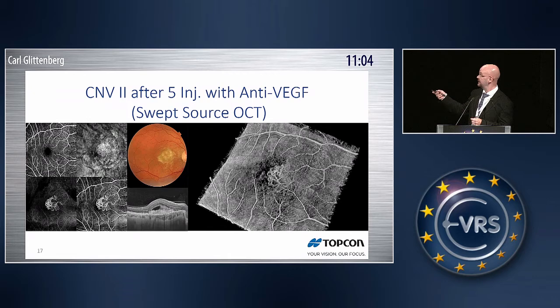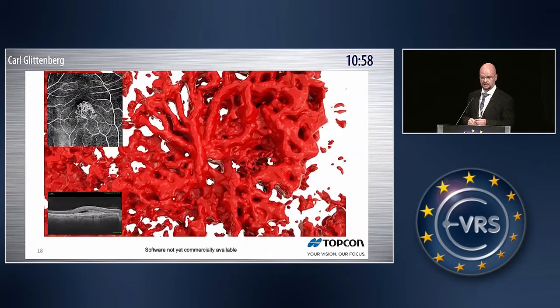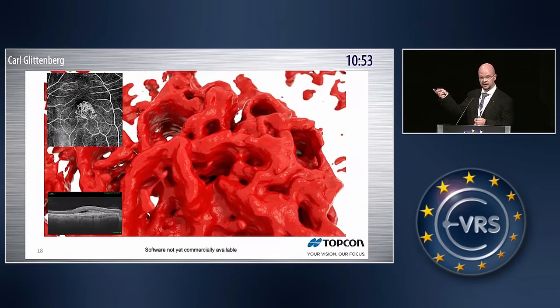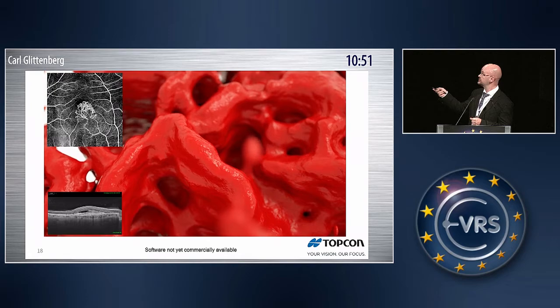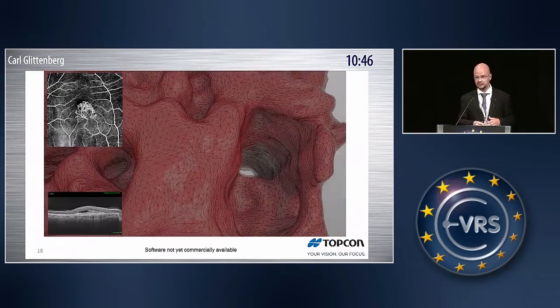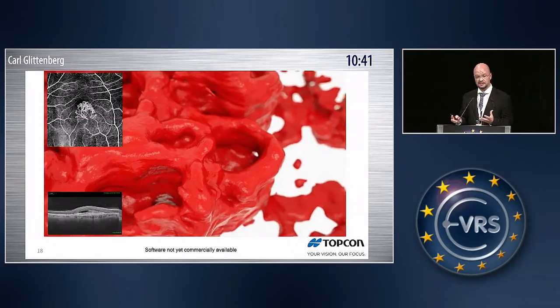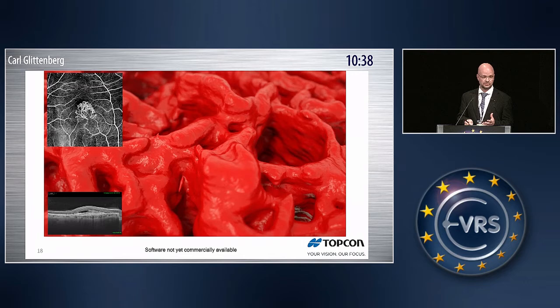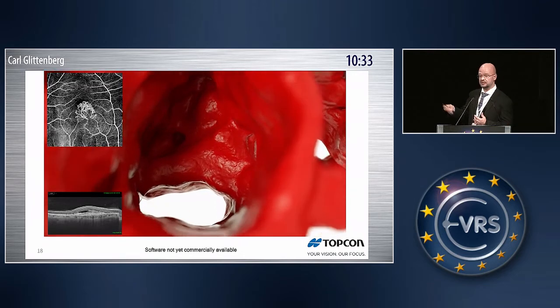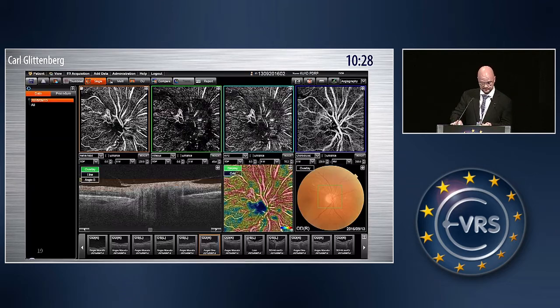But I had a discussion with Professor Koskas regarding the fact that these activity criteria were based on a 2-dimensional image. But the actual lesion is 3-dimensional. So what I worked on was a way of segmenting the choroidal neovascularization 3-dimensionally and giving it a 3-dimensional triangle mesh segmentation so that we can then use it for fluid dynamic simulation and volumetric analysis, and then really start to get a much better understanding of the activity criteria, so that we don't have to do 3-dimensional fractal dimension analysis, which is extremely complicated. If we can do it in this way, we can save ourselves a lot of computational time and also spare our artificial intelligence.